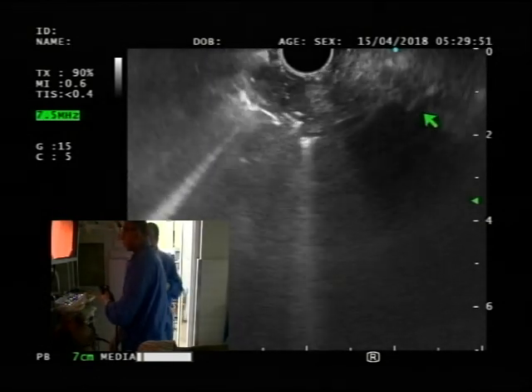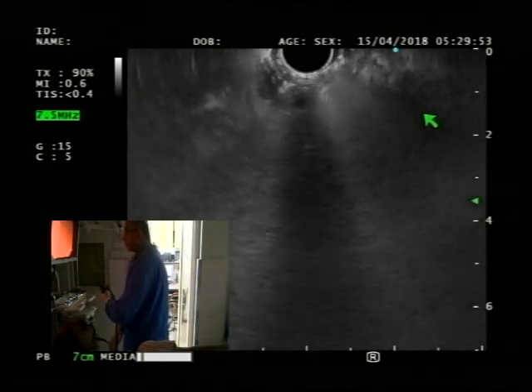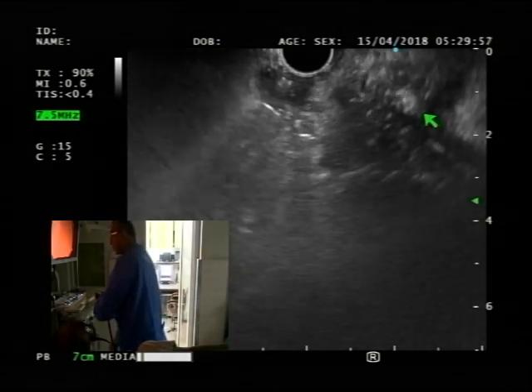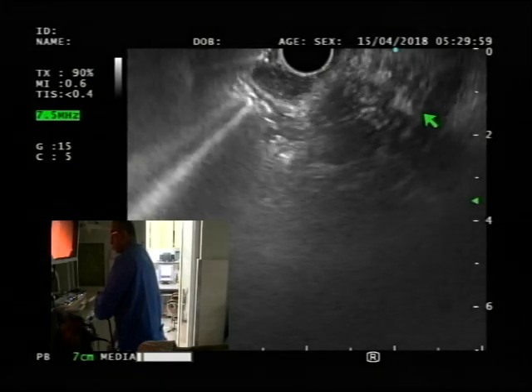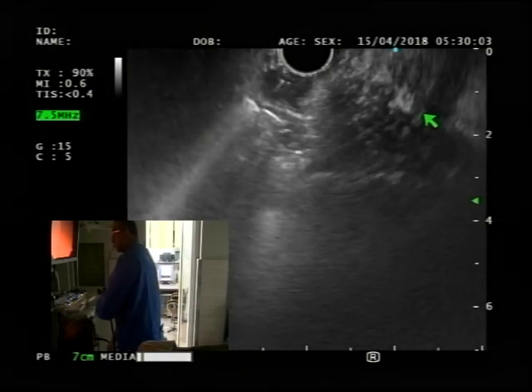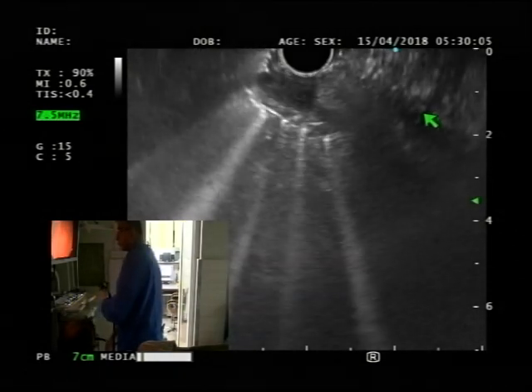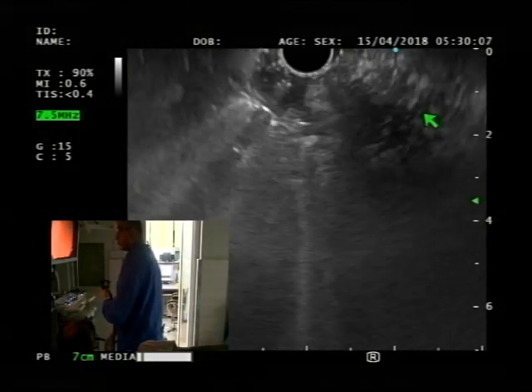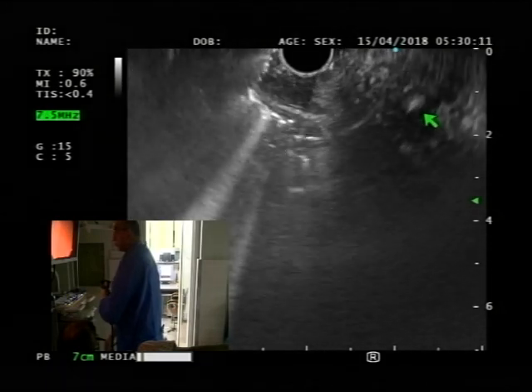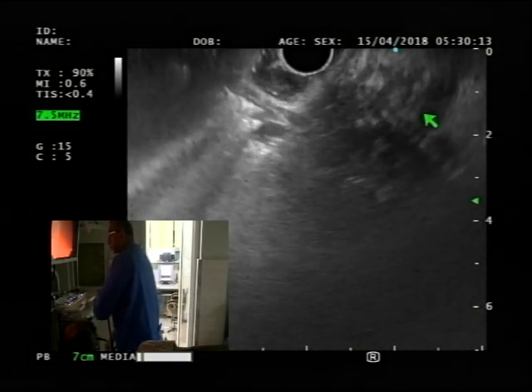Let me go 8 seconds. But see how that is. And in a certain measurement, if you feel you've got tissue, then you're fine. Now that's even more subjective. There is less subjectivity in that. No, we're waiting for the second one now.